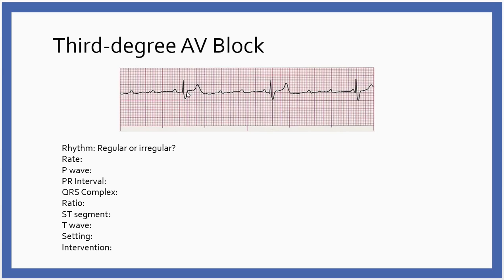I'm wondering, because I've got P waves spaced out, if I make a little ruler, make yourselves a paper ruler and put a mark here and a mark here. I know these are P waves. And then move that ruler down so that your first mark is here. Your second mark is probably going to be right here. Yes, there's likely a P wave on top of this T wave.